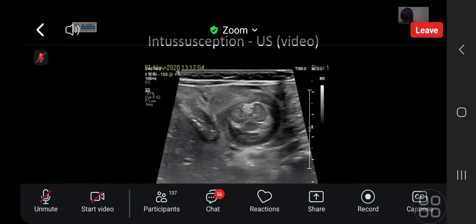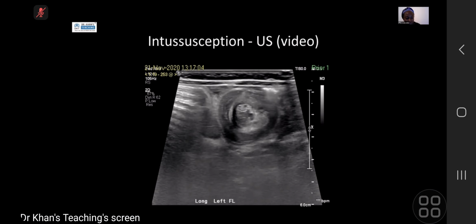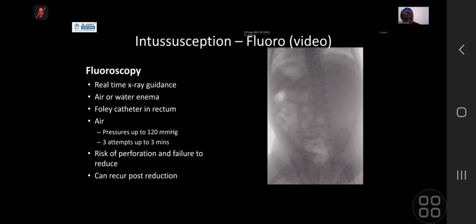I think that's it, really. It's just a nice video that shows it all the way through. Next one is this one, the reduction one. Okay, so this is a reduction. It goes very quickly, so we'll just play it a couple of times.